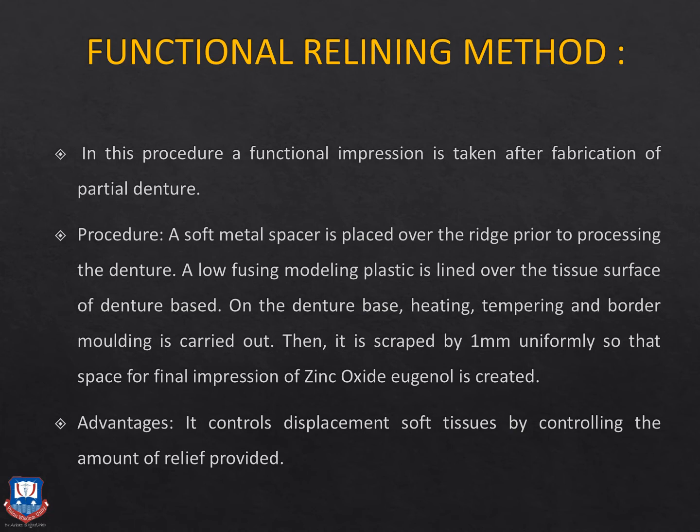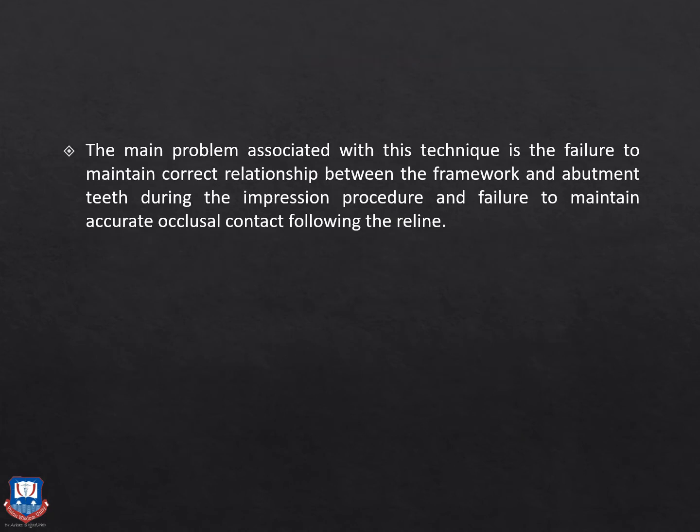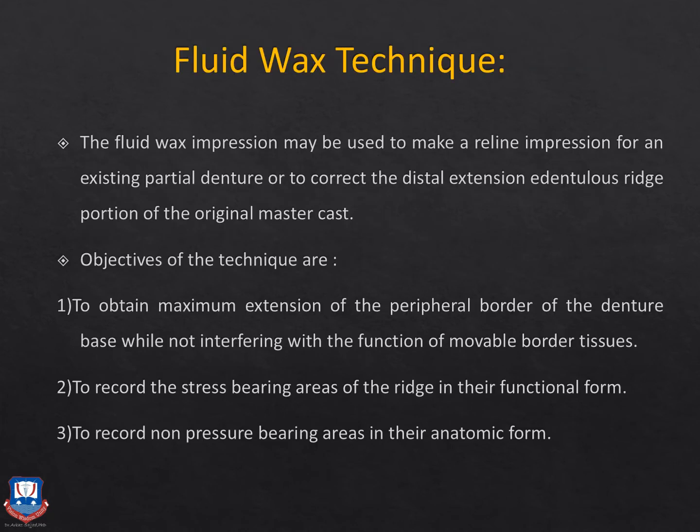So relining is done as a last resort, which may be done at the trying appointment or at the denture insertion appointment, and then the denture is given to the patient in the next appointment. So basically, there's nothing more to it.